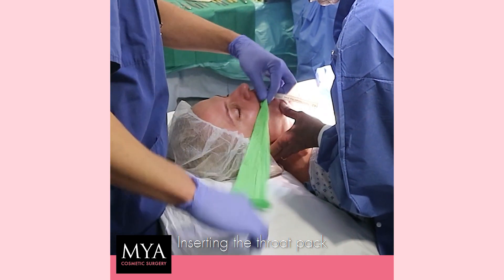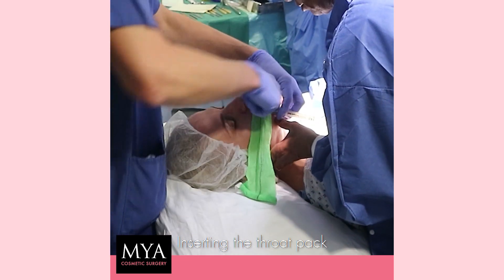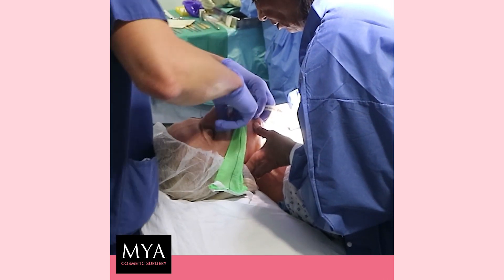You have to be very gentle with the patient's airway. That's a routine procedure for the safety of the patient. Thank you.